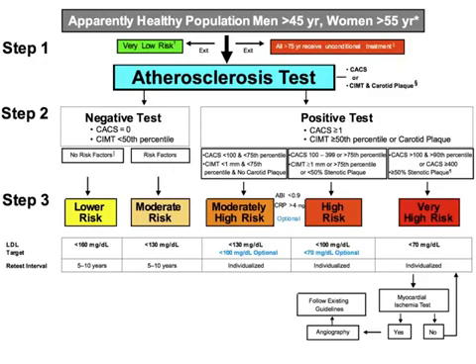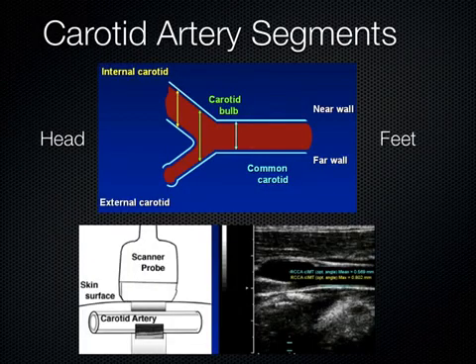But now that the machines are in the clinician's hands, if you're going into primary care, this is another great potential use. You can use it to risk stratify your patients and help direct therapy. So that's the idea going on with this. How do you do it?